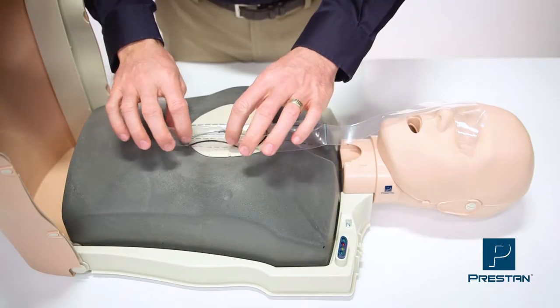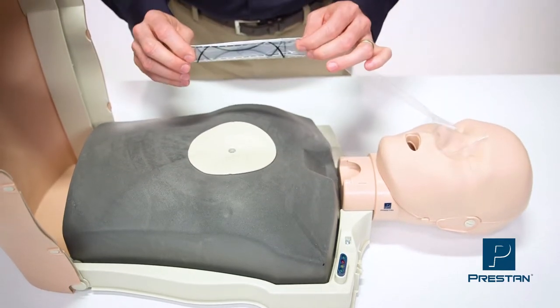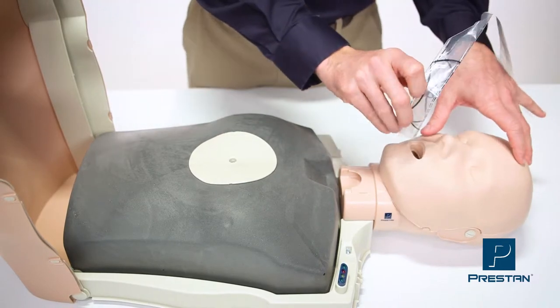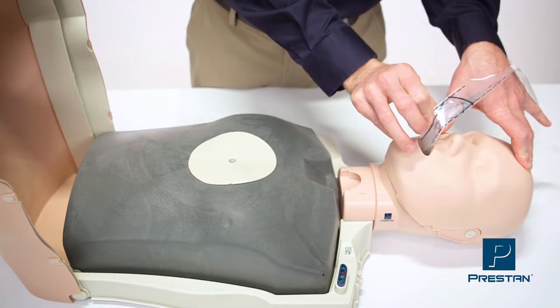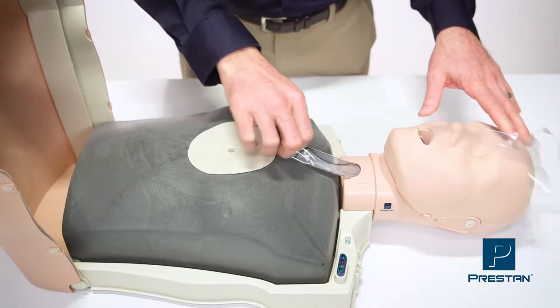Next, fold the lung bag vertically along the dotted lines so that the lung bag looks like this. Tilt back the head and insert the lung bag through the mouth and neck, then pull the lung bag down.